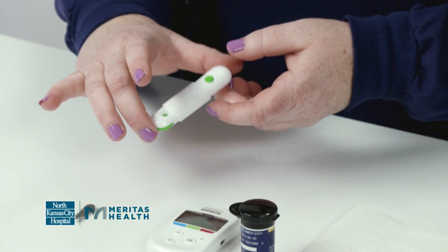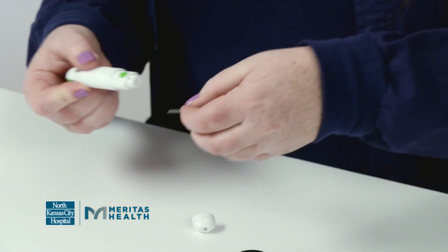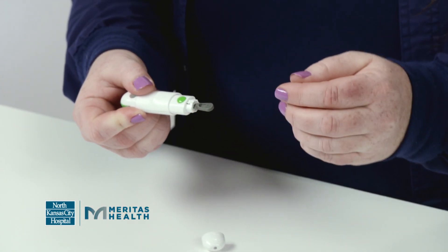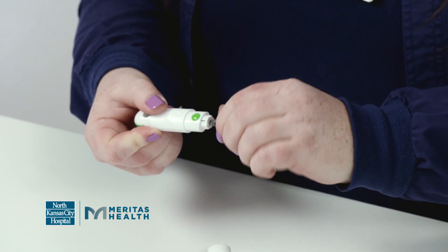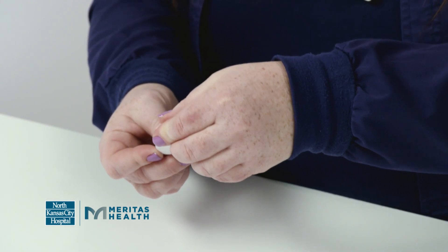We're going to load the lancet device first. You're going to twist off the top, take your lancet, and put it inside. Then twist off the top to expose the sharp point, and put the cap back on.